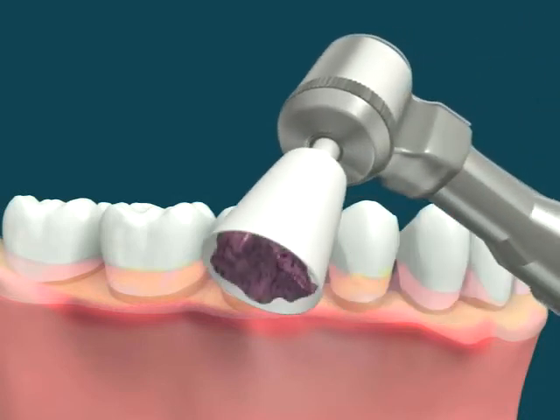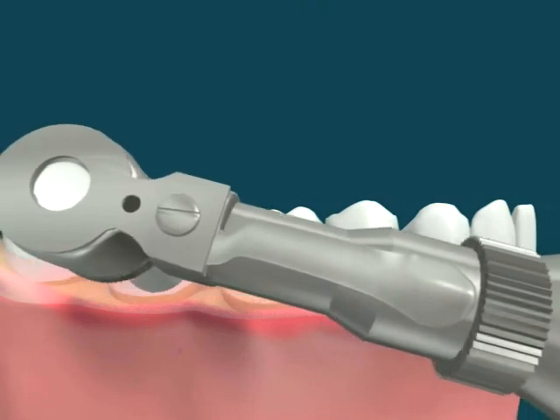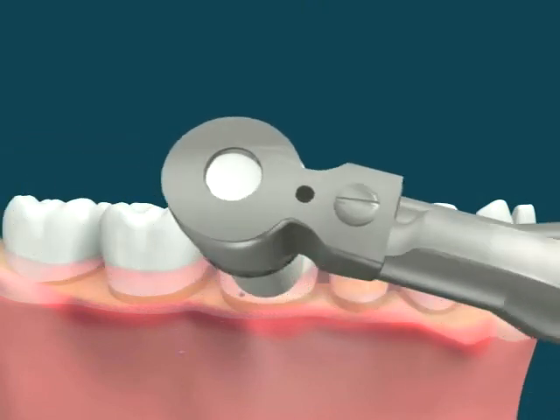Some stains may still be present on the teeth. Profi Paste and Profi Rubber Cups are used to polish the stained teeth. After cleaning and scaling, the tissues regain their health.